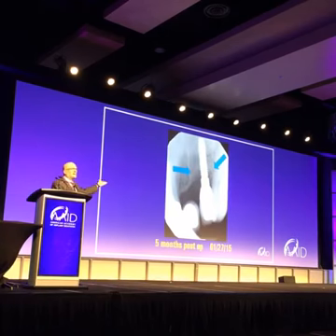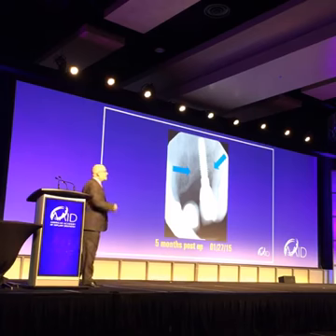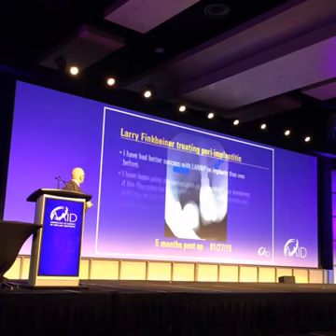5 months later, the bone's back pretty much to where it should have started, back to the crest of the implant abutment interface. No exogenous bone, no biomimetics, no BMPs, nothing. Just did the LAPIP protocol.